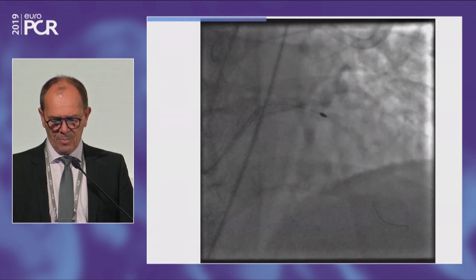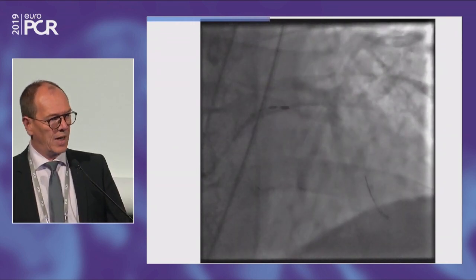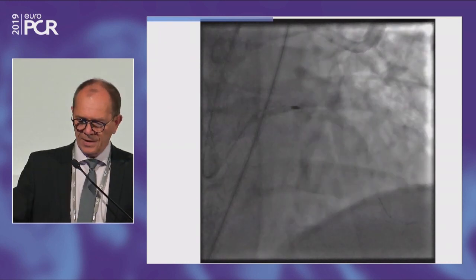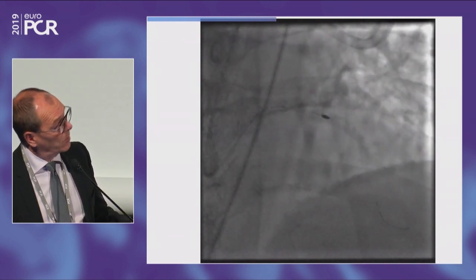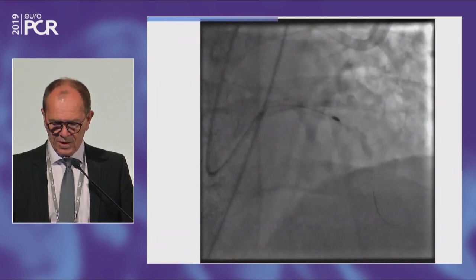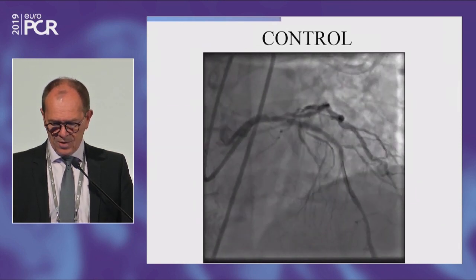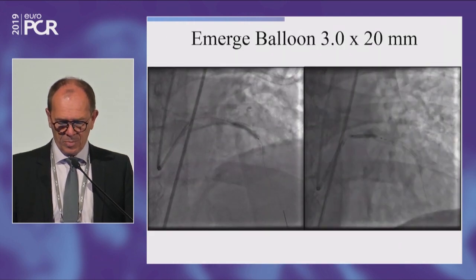The burr is a 1.5, was stuck in the distal left main, whatever the high speed were used. And finally, I succeeded to cross, and I decided to rotablate also the second lesion on the LAD to be comfortable to set the stent. So rapidly, the check didn't show any perforation, so let's go for the follow-up.